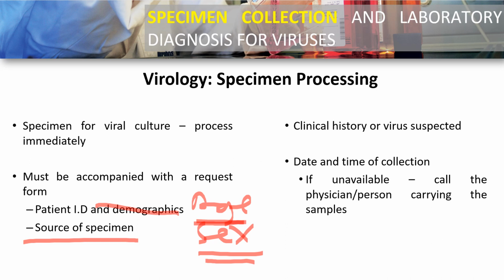Then, date and time of collection. So, if unavailable, you need to call the physician or person carrying the samples. Bakit importante talaga ang date saka time of collection, class? Always remember that viruses are very sensitive and easily destroyed. So, pag masyadong matagal na yung sample, then the virus is destroyed, what will happen? You will release a result na negative. So, what will happen to the patient? The patient will die. Sinong may kasalanan?